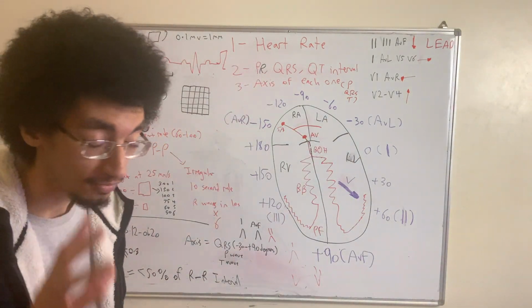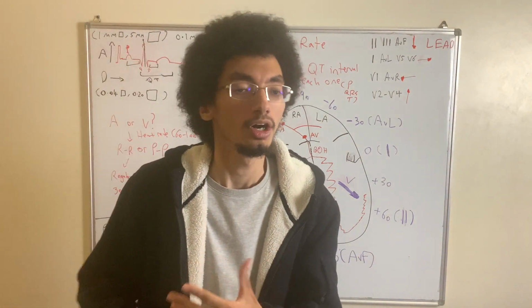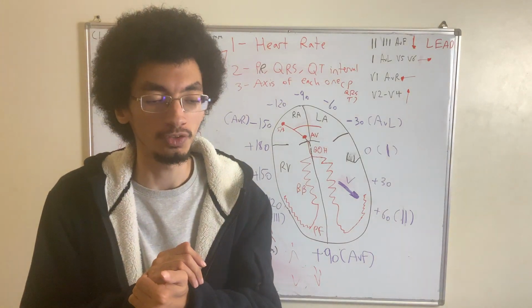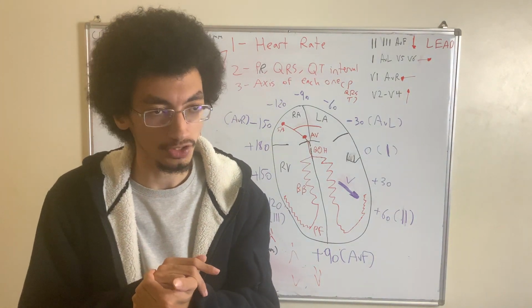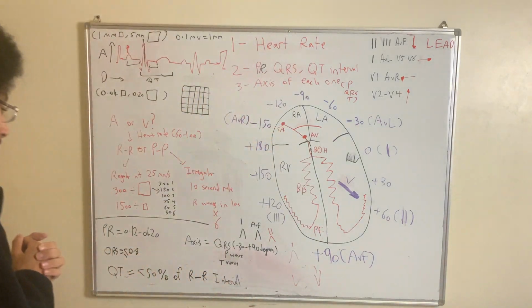And this is a very important concept to know because it's a non-specific sign of abnormalities we'll see inshallah in future videos, like bundle branch blocks, like hypertrophy, and so forth. We'll come to it later on.